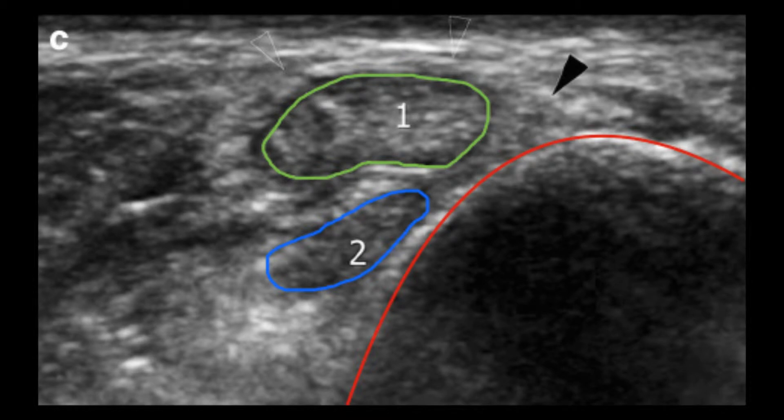This is a great axial image of the peroneus longus and the peroneus brevis as they're passing by the fibula. Figures one and two represent the peroneus longus and the peroneus brevis respectively — the green one is the peroneus longus and the blue indicates the peroneus brevis.